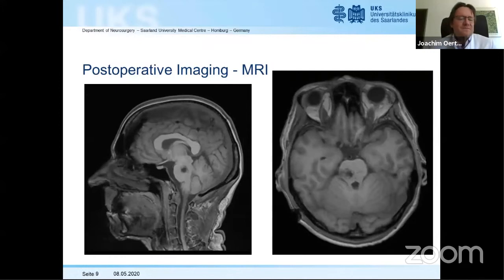Any questions? Okay, any questions? If anybody has any question, please raise your hands. What is the trick for going in the delicate areas like that? And would you always do tractography before you go in?